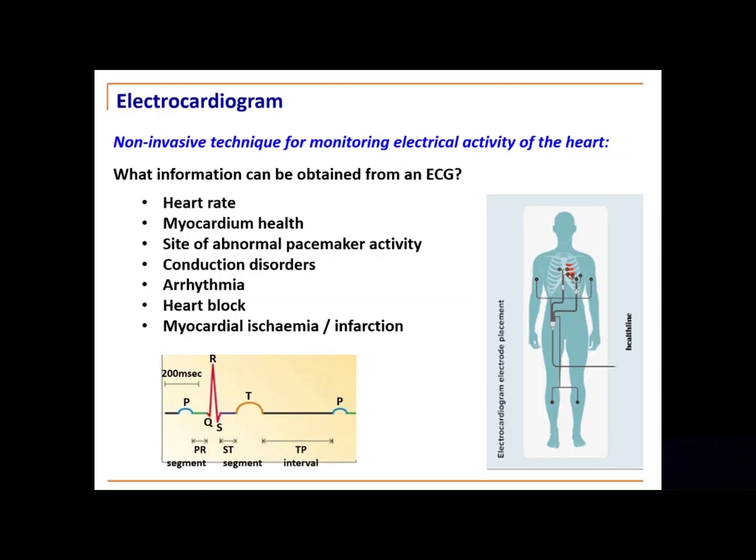Why do we measure an ECG? Well, it's non-invasive. That's very useful. It gives us lots of good information about the electrical activity of the heart. So what is the heart rate? That's easy to measure in an ECG.